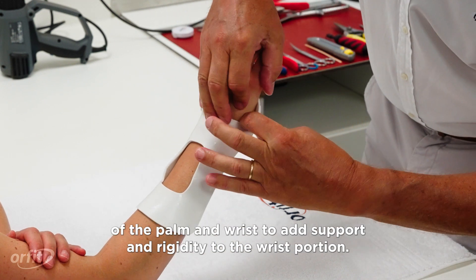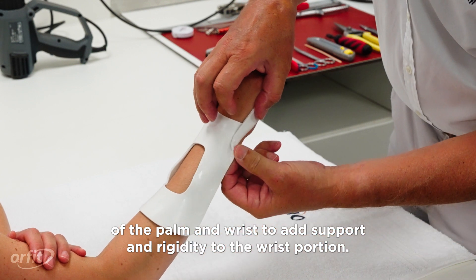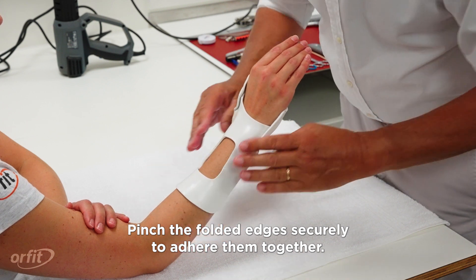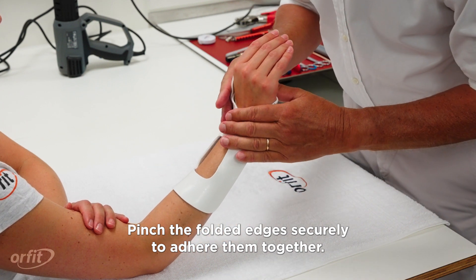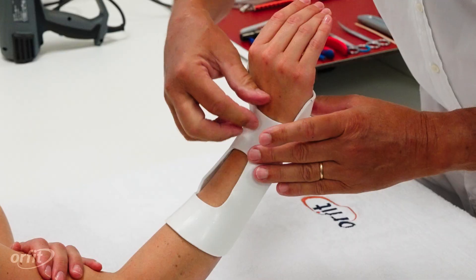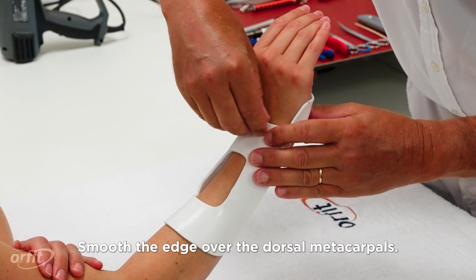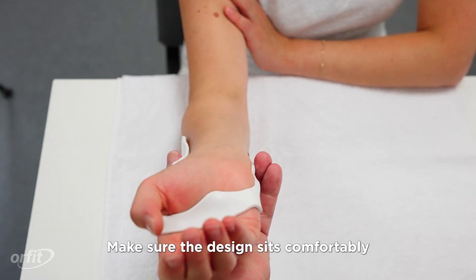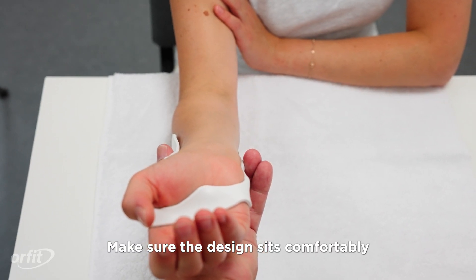This ensures full finger flexion of the MCP joints. Fold over the flap on the radial side and then on the ulnar side of the palm and wrist to add support and rigidity to the wrist portion. Pinch these folded edges securely to adhere them together and smooth the edge over the dorsal metacarpals.